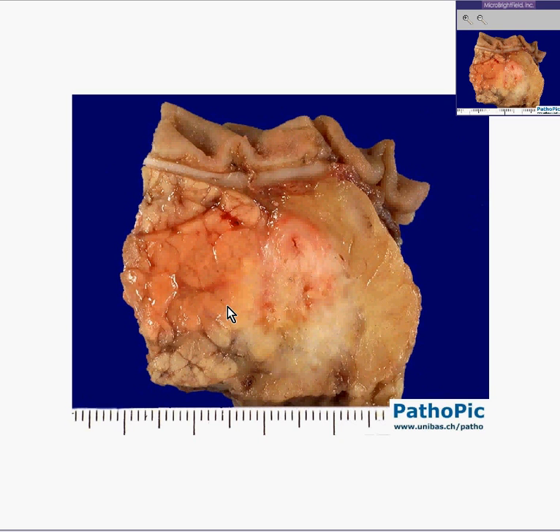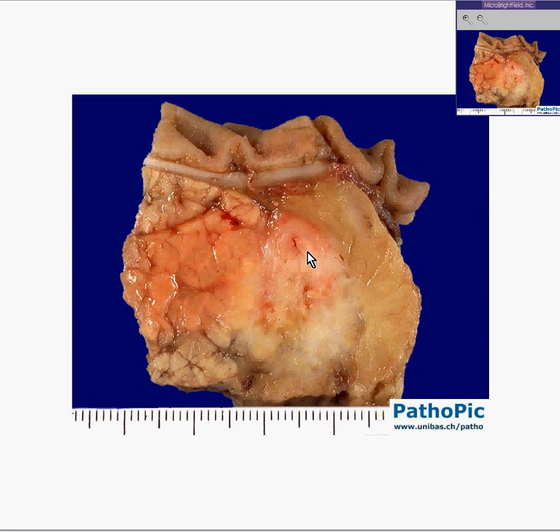But look at this part — it's not lobulated at all. And not only is it not lobulated, but it's very poorly defined from the surrounding normal structures. In other words, it's invading them. And if this, for example, was a common bile duct here, you can see that the tumor has grown completely around it and could very well be completely obstructing it.